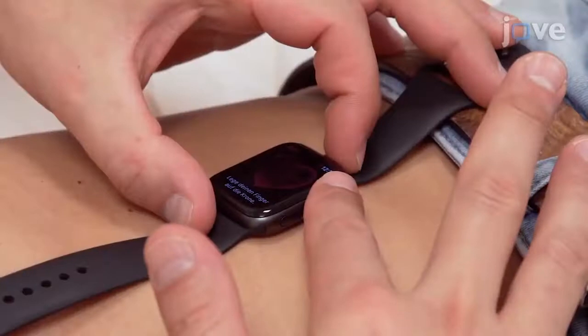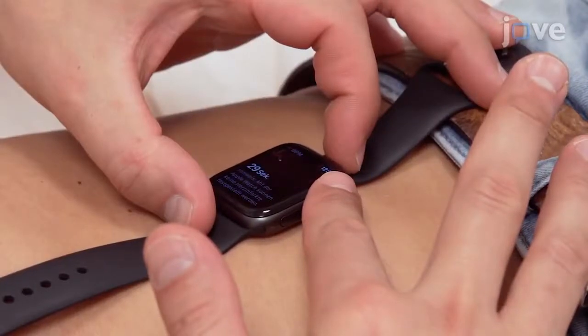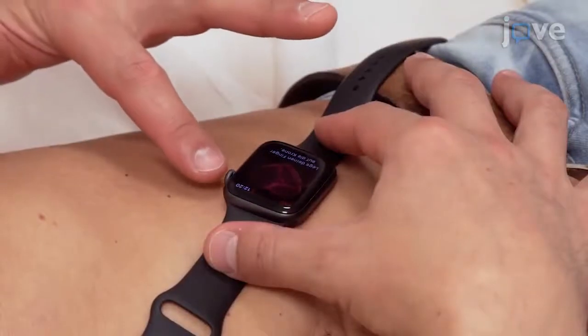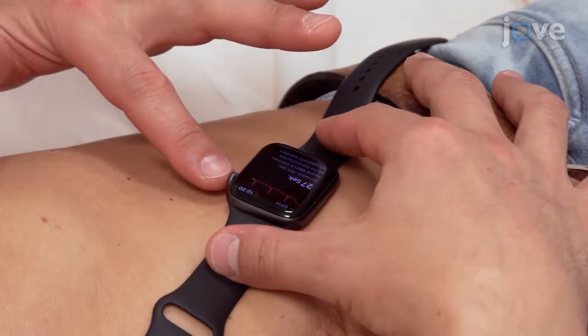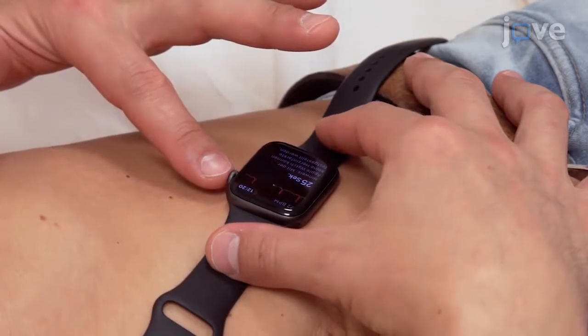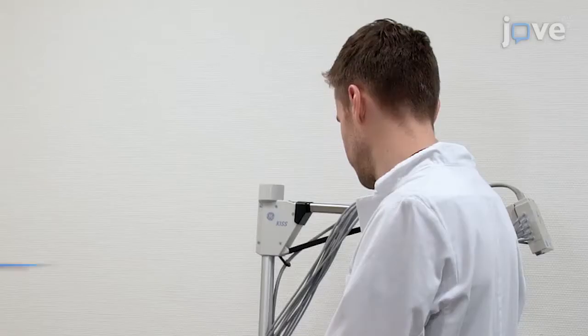It is important that the subject is able to generate good skin contact, especially during recording of leads 2 and 3. It may be difficult to record Eindhoven leads 2 and 3 because the watch has to be placed on the lower abdomen of the individual. Therefore, a resting position is mandatory. Demonstrating the procedure will be Sven Kaeser, a colleague from our department.